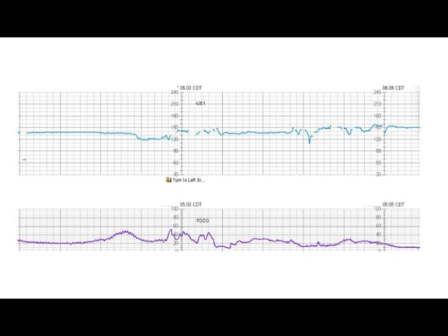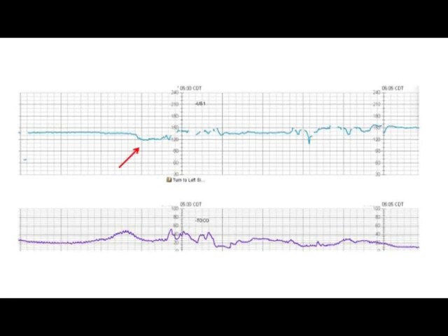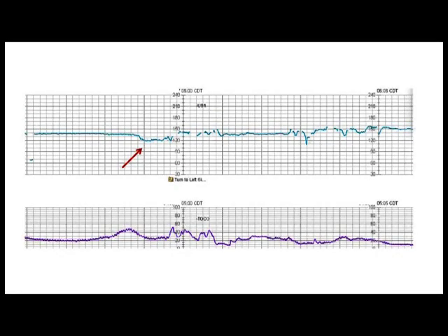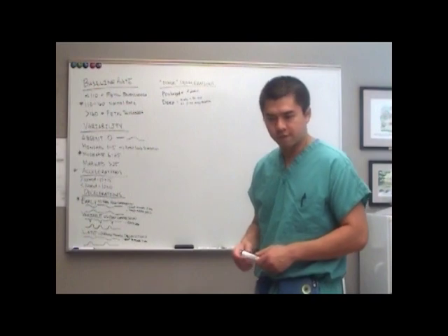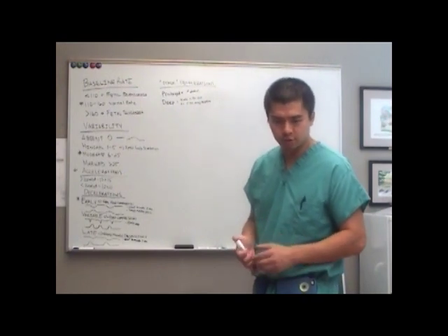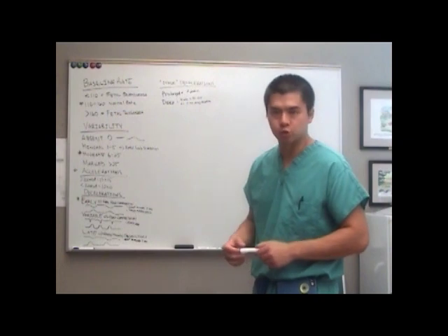I would call these late decelerations. So these decelerations are only dropping down about 5. So they're barely dropping. So do they even meet the definition for a late deceleration? Yep, they still do because they're gradual. They take about 30 seconds or more to get down to the trough, and then their onset, trough, and recovery in general are after the onset, peak, and ending of the contraction.